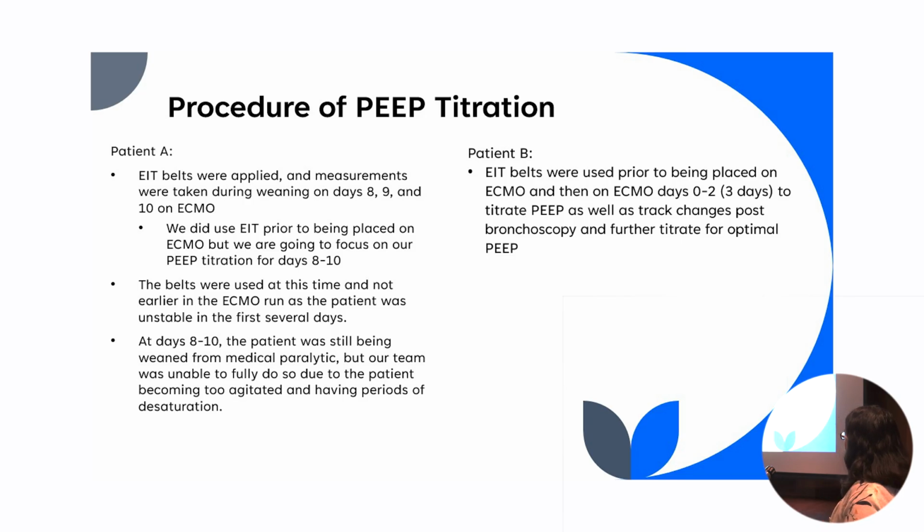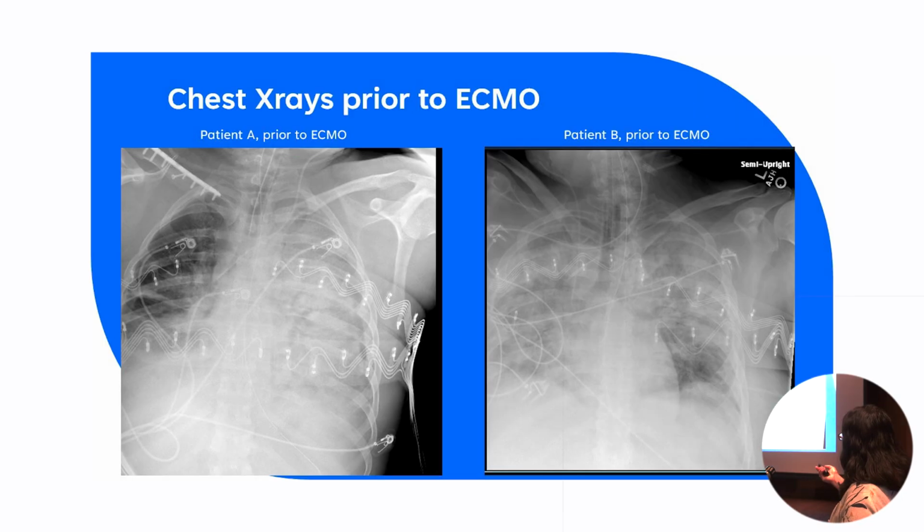And then for patient B, we were able to utilize the PEEP titration in the first 3 days of being on ECMO, as well as track changes when we did a bronchoscopy, and we'll go into that more in depth.